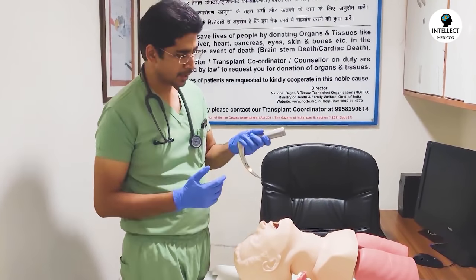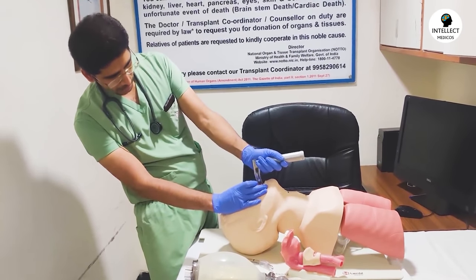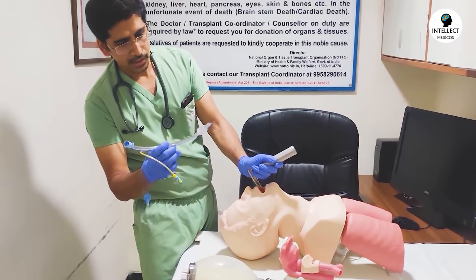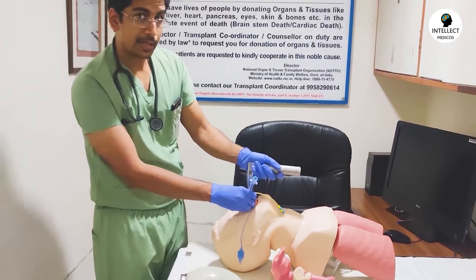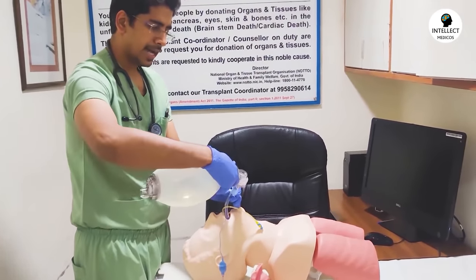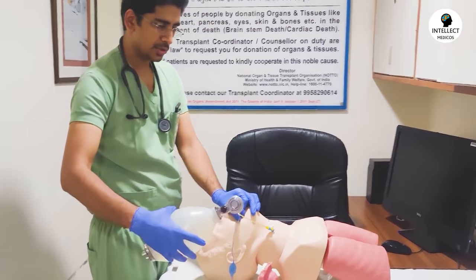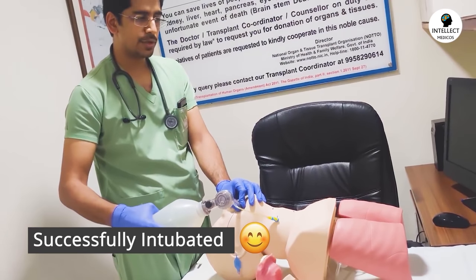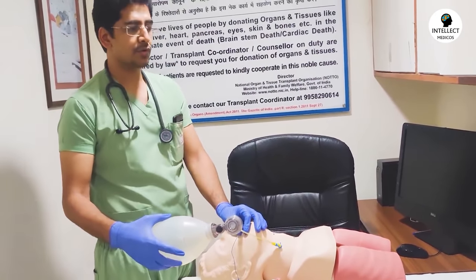With the laryngoscope in one hand, after visualizing the epiglottis and lifting it, take the lubricated endotracheal tube in the other hand and insert it until the black mark crosses the vocal cords. After insertion, inflate the cuff using the pilot balloon and attach the resuscitation bag. Hold the endotracheal tube at the angle of the mouth so it doesn't slide in. Ventilate the patient — visible lung inflation confirms tracheal placement; no chest rise would suggest esophageal intubation.